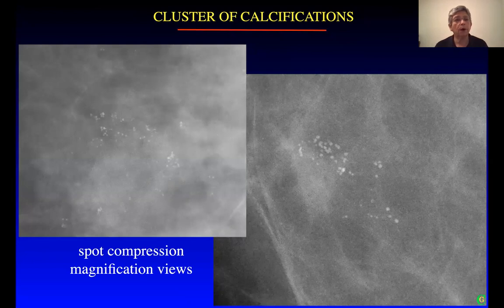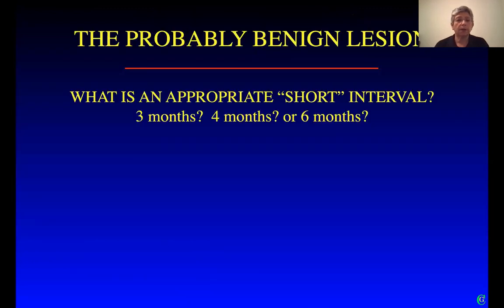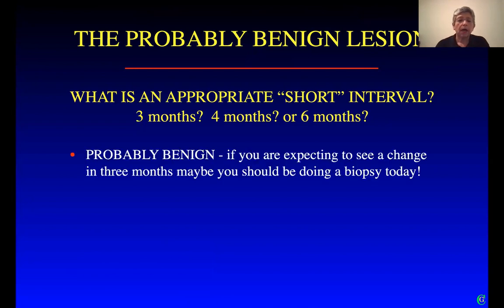This falls into the probably benign category that can be followed with a 6-month follow-up. Now let's spend some time talking about what is an appropriate short interval follow-up. Is it 3 months? Is it 4 months? Is it 6 months? I would argue that these are probably benign lesions where at the very beginning we said the likelihood of malignancy is low.